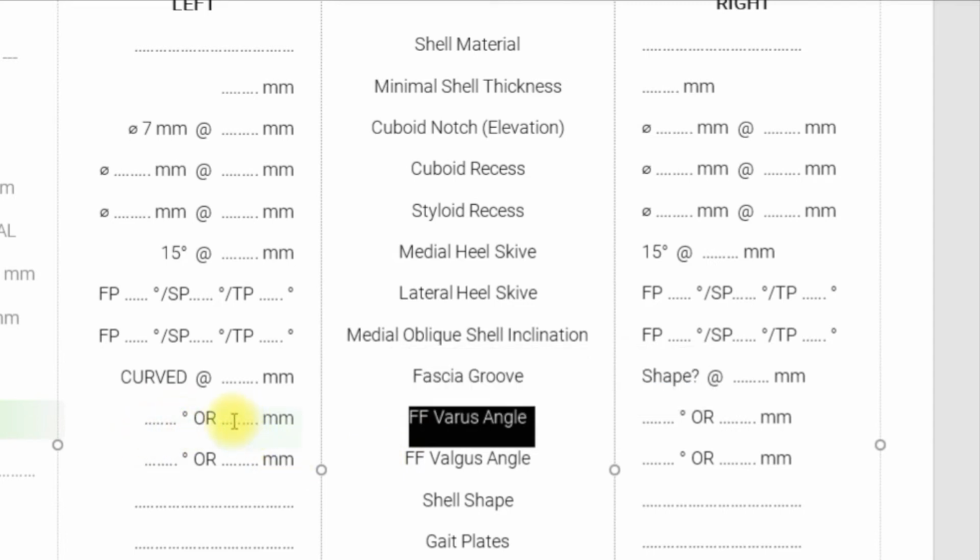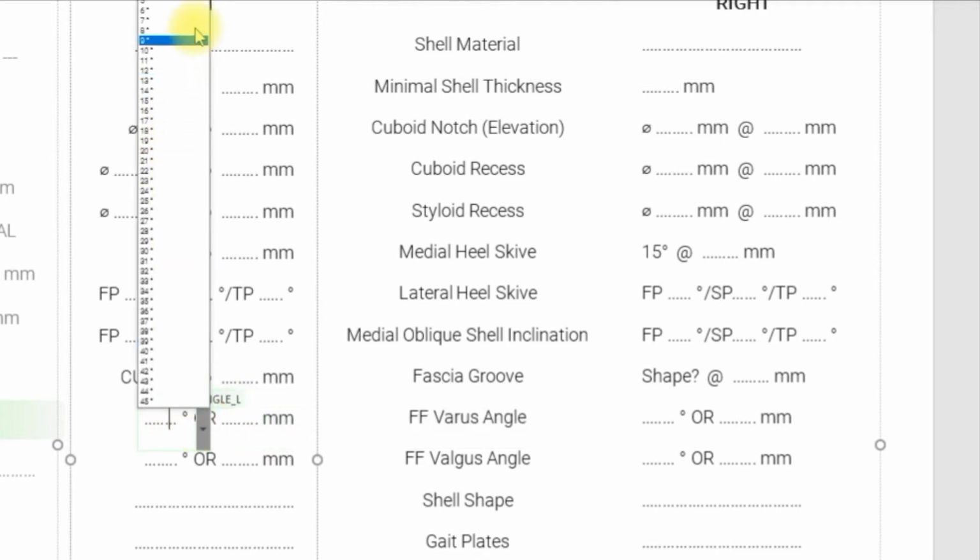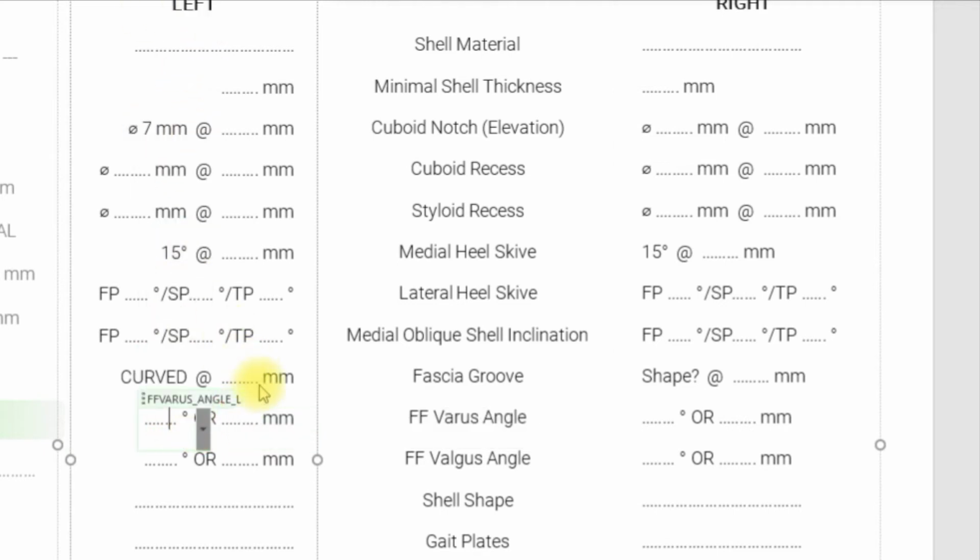Obviously negative degrees at the forefoot will mean, at the Varus, will mean inverted, a valgus, but you won't be able to do that into the input there. There's no negative numbers. Okay, so Varus angle, or how high you want it from the medial side of the device. Okay, how high or low, left and right.